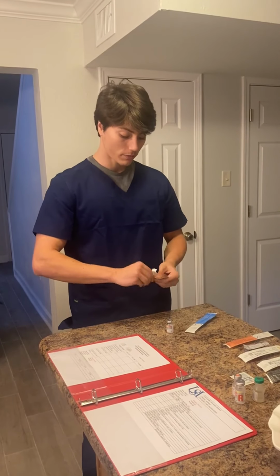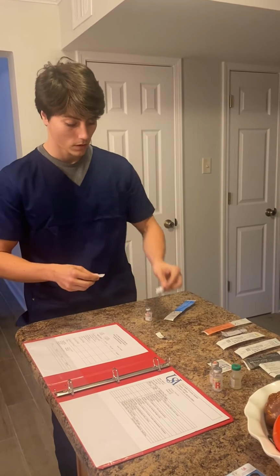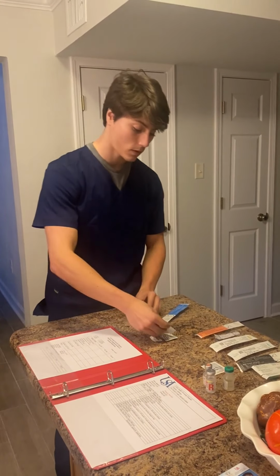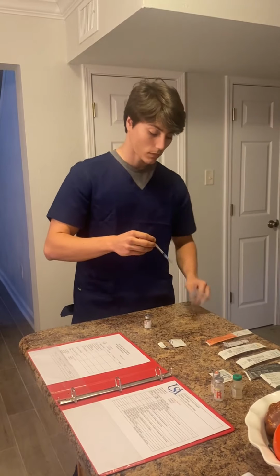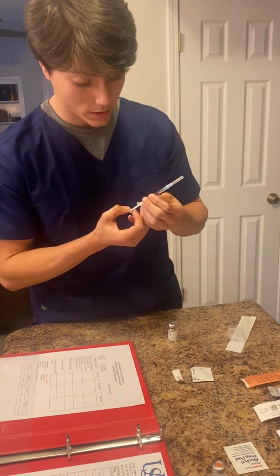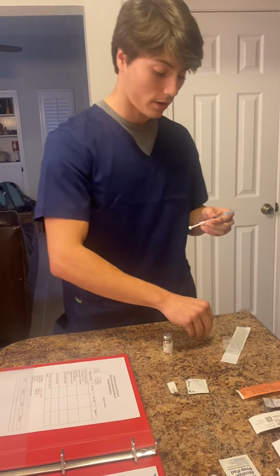So the first thing I'm going to do before I draw up the medication is clean the top of it with an alcohol wipe. Okay. And so while that dries, I'm going to go ahead and draw up 0.5 milliliters of air and prepare to inject that into the vial.